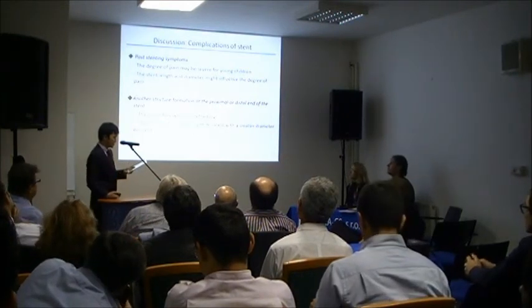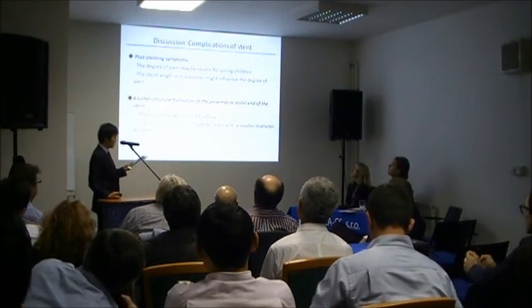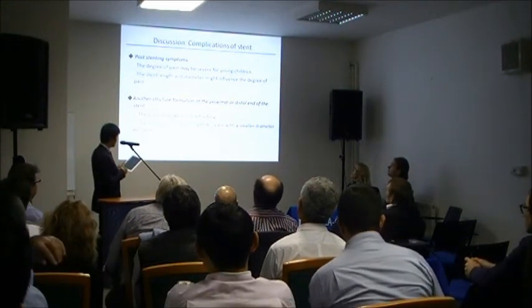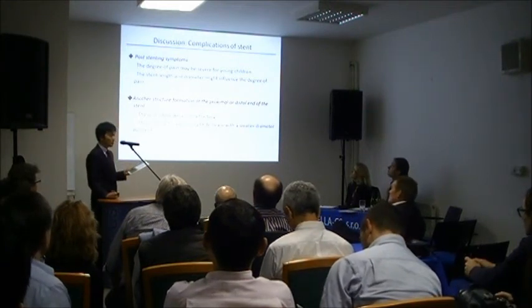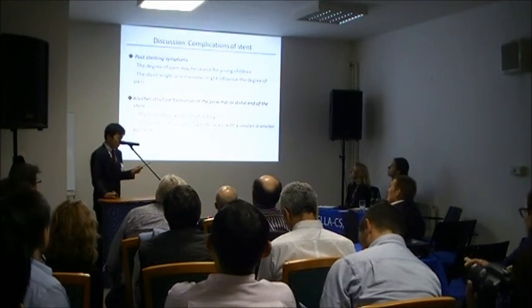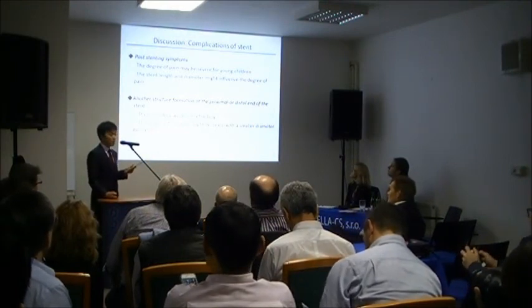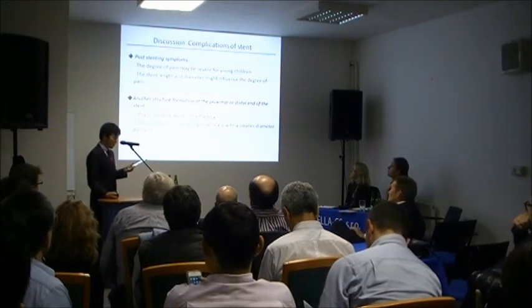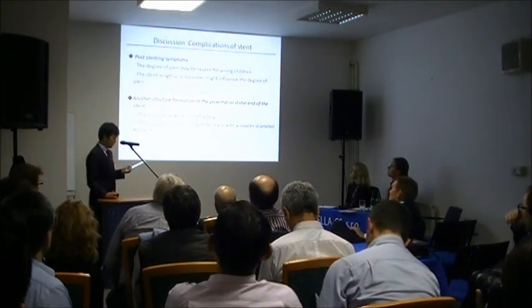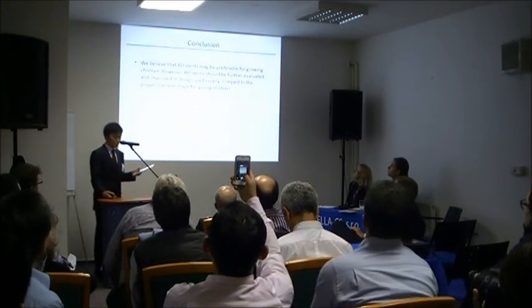Our experience suggests the problems of using a BD stent were post-stenting symptoms and another stricture formation at the proximal or distal end of each stent. We especially think that when we use a BD stent for a young child, pain control is one of the most important things. Ladies and gentlemen, this is our conclusion.